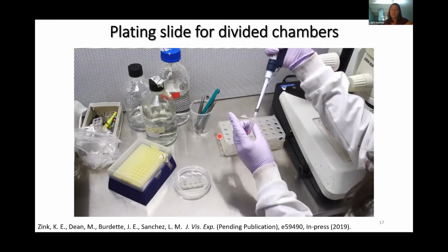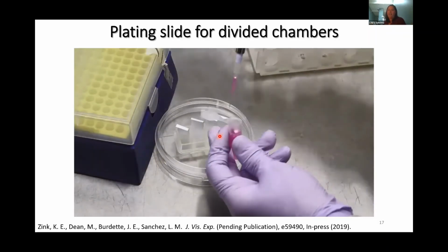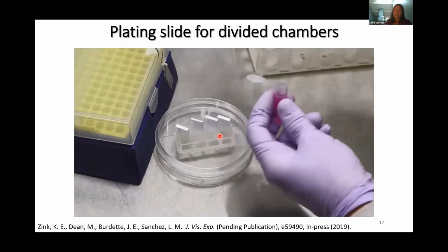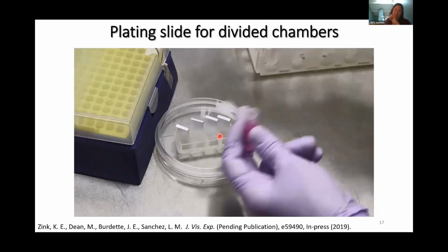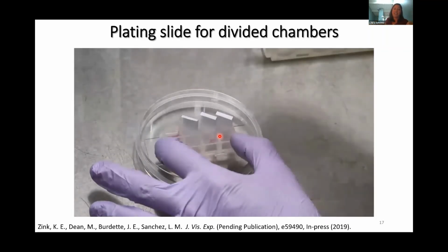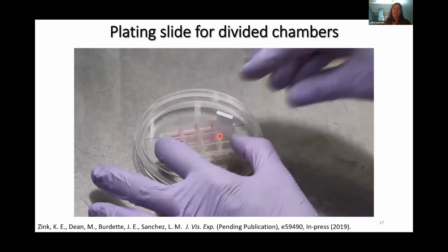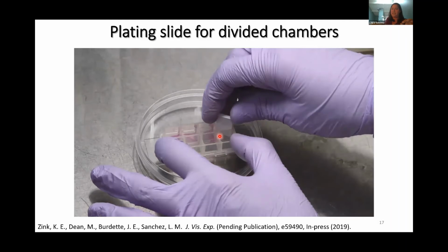And so you can see here, she's just mixing all these things up. And then she'll pour that on 1/2. And then the nice thing about these little plastic removable dividers is that they can be removed. So what you're just seeing now is what it looks like to pour half of these, and you'll see in the takeaway, you get a nice little triangle. So after we have that, what Catherine then does is to place the ovary.